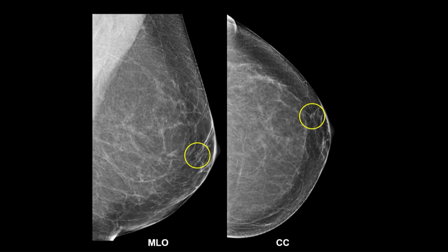But since you know she's had a breast reduction, she must have had mammograms before that. And who knows how many other mammograms she might have had since then. It's helpful to ask for those priors. They just might affect your decision of what to do about these calcifications.